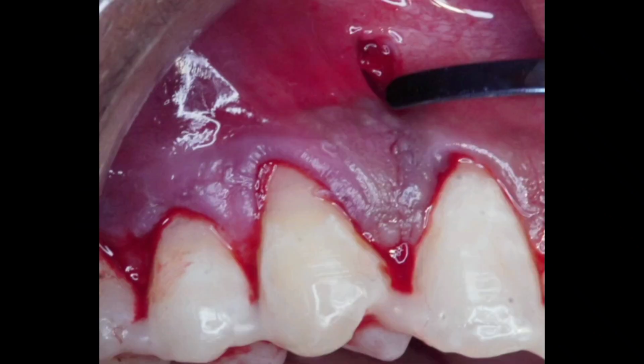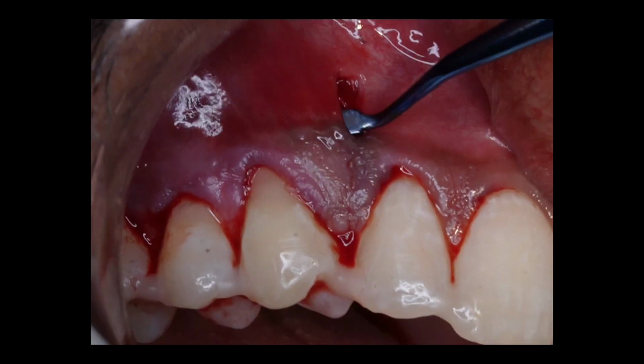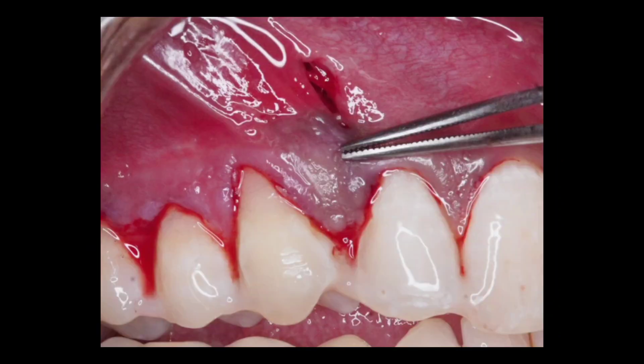So we insert this instrument now through the VISTA tunnel, and after the insertion we break down the remaining fibers to create a uniform path or single plane of insertion for the connective tissue graft.